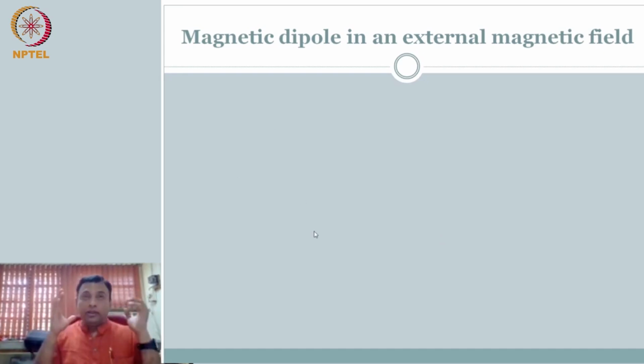Again, think about it. We talked about the analogy between the spin and the bar magnet, the spinning proton and the bar magnet. And what we noticed is, if you take bar magnets and put them on the table, you may have 10 pieces, and you throw them such that they are all falling in different directions initially. But then you will notice that quickly they will all align to the Earth's magnetic field. That is, when you subject them to an external magnetic field, which is the Earth's magnetic field, they will all nicely align themselves. Of course, you have to give some finite time. You throw it and then quickly it will all reorient.